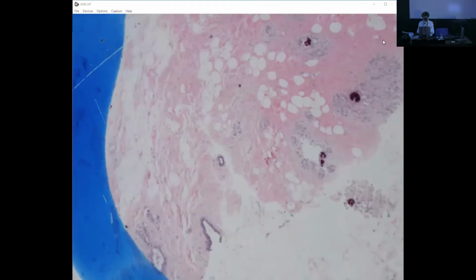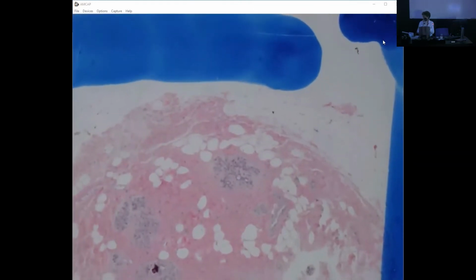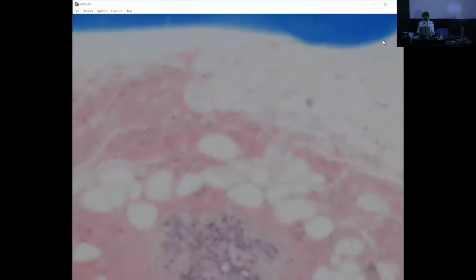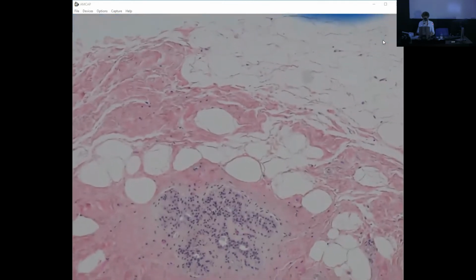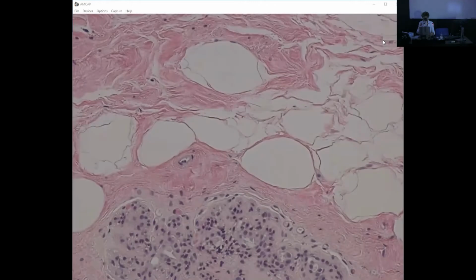Like in adenomyoepithelioma, maybe. That's the morphology. It reminds me of a flower, with petals, no? Yes, you think there is a flowery appearance here? Yeah, it looks like, I'm romantic, yes. That's an interesting thing. I have also a couple of cases that were so floral. I will send you the pictures.